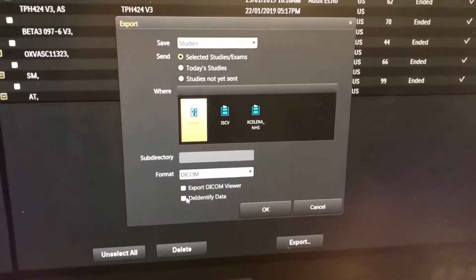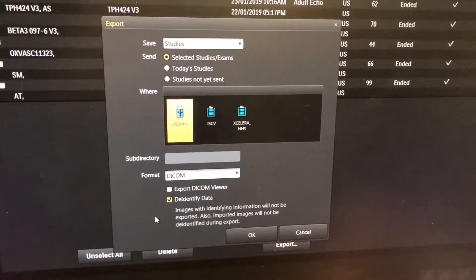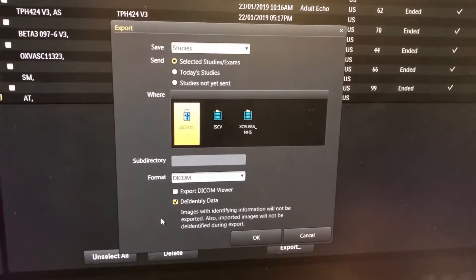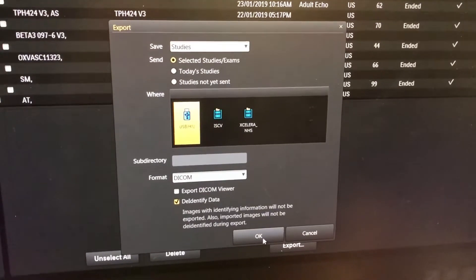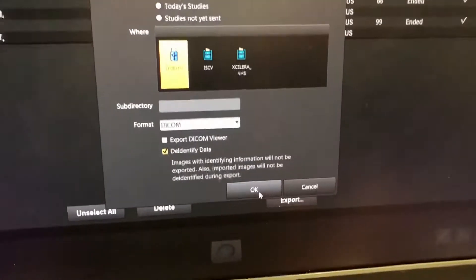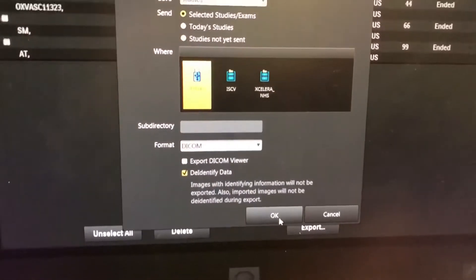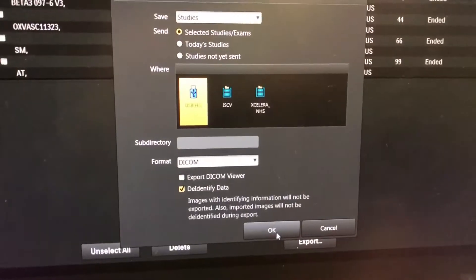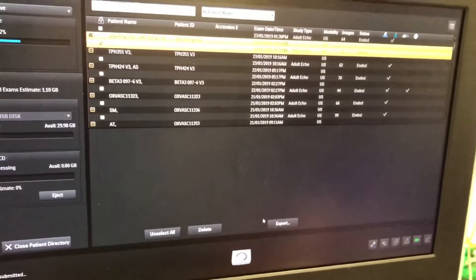This screen will then appear. Select the drive that you want to export to. Save studies — selected studies in the format DICOM — and you can remove the identifying data there. Click export and that should be complete for you.